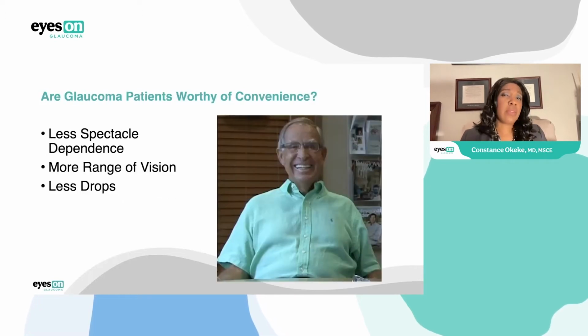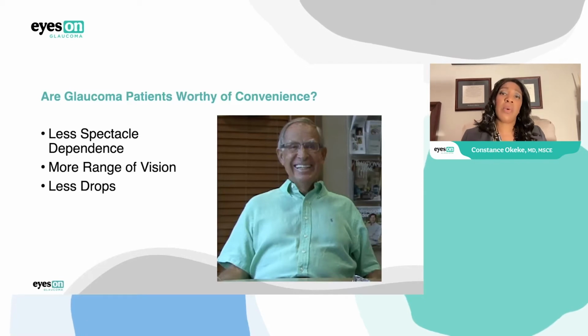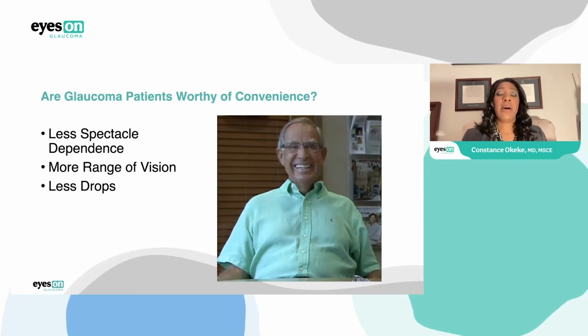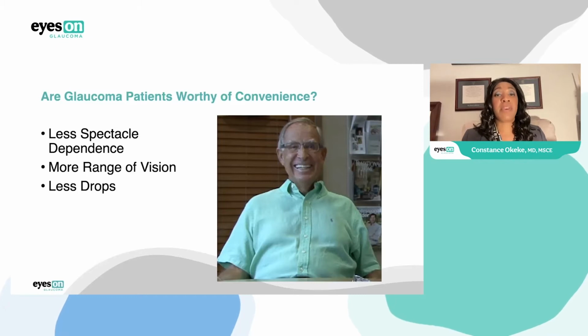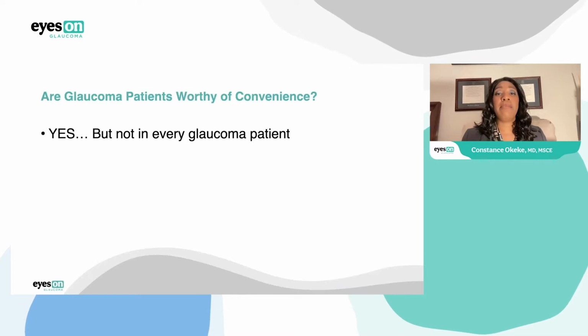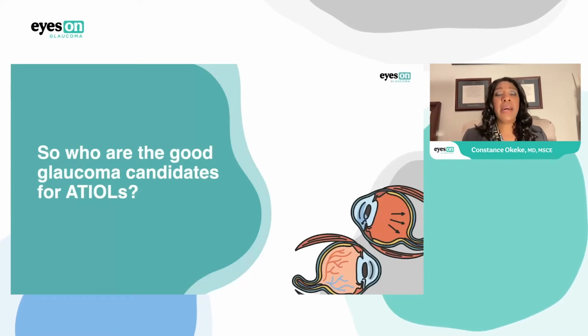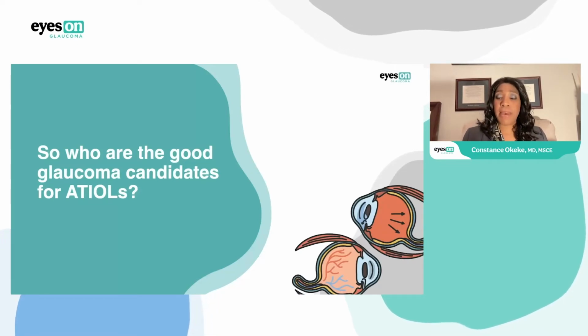So one question is, are our glaucoma patients worthy of the convenience that does come along with advanced technology lenses and spectacle independence, where they can have increased range of vision and also, if coupled with minimally invasive glaucoma surgery, fewer drops? Well, I say that the answer to that question is a strong yes, but the option is not necessarily there for every glaucoma patient. So, who are the good glaucoma candidates that advanced technology lenses can benefit?